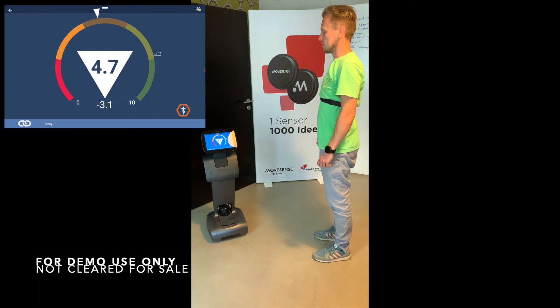Your score is 4.7 and your previous score was 7.8. Compared to your last measurement, it got worse by minus 3.1.